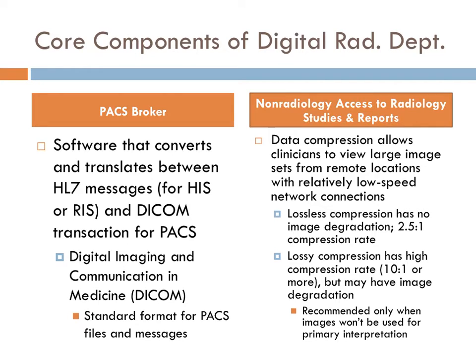So if a radiologist is looking at an image, you do not want the image to require any sort of lossy compression. But if a clinician is just reading a radiology report and sees in the report what the problem is and wants to just correlate that with the actual image, he can pull up the image and it can be a lossy compression image because he is not actually interpreting the image. He is just correlating what he sees on the report to the image.